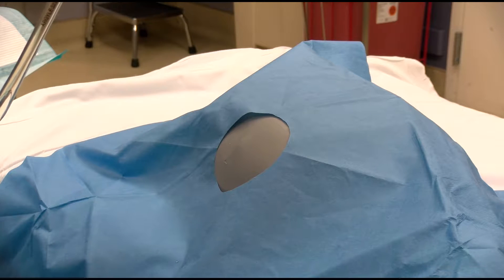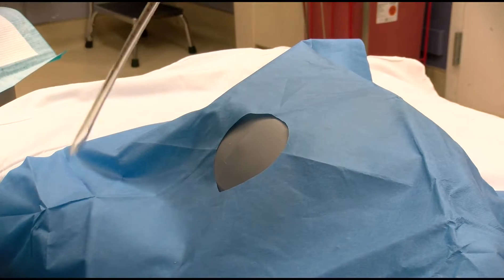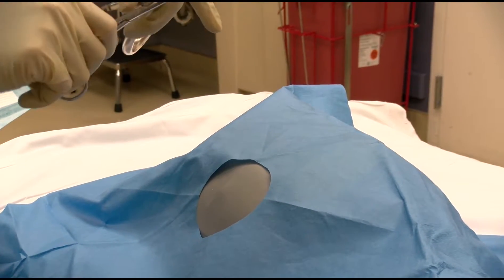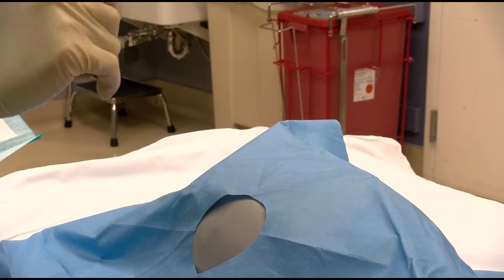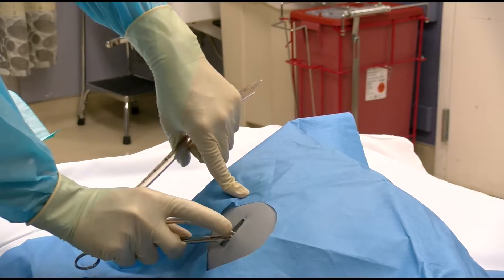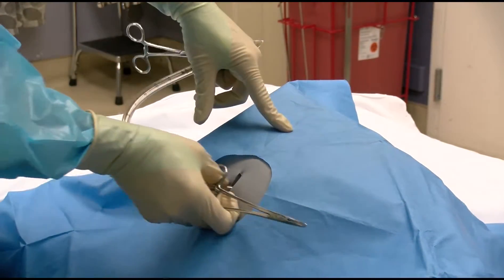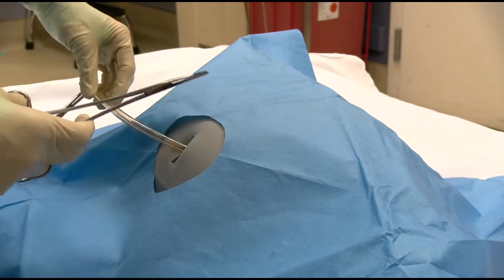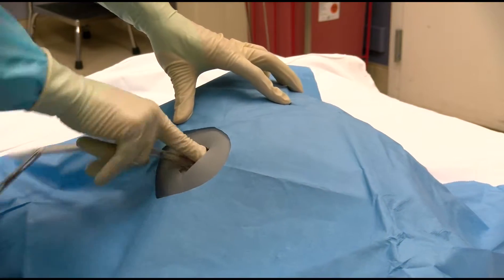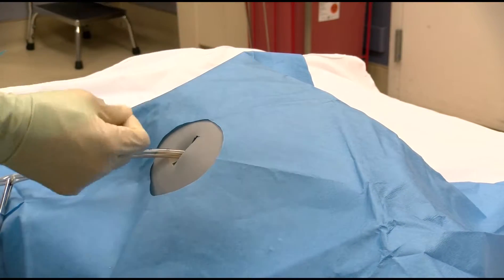Now measure the chest tube to the level of the clavicle to note the expected insertion depth. The numbers on the side of the tube indicate the distance to the last fenestration on the tube. Clamp the pointed end of the chest tube to control any leakage of blood or other fluid upon tube insertion and use the curved hemostat to assist with directing the tube into the newly created defect in the chest wall, ensuring that the tube is entering the thoracic cavity and not being directed in a false passage in the subcutaneous space.